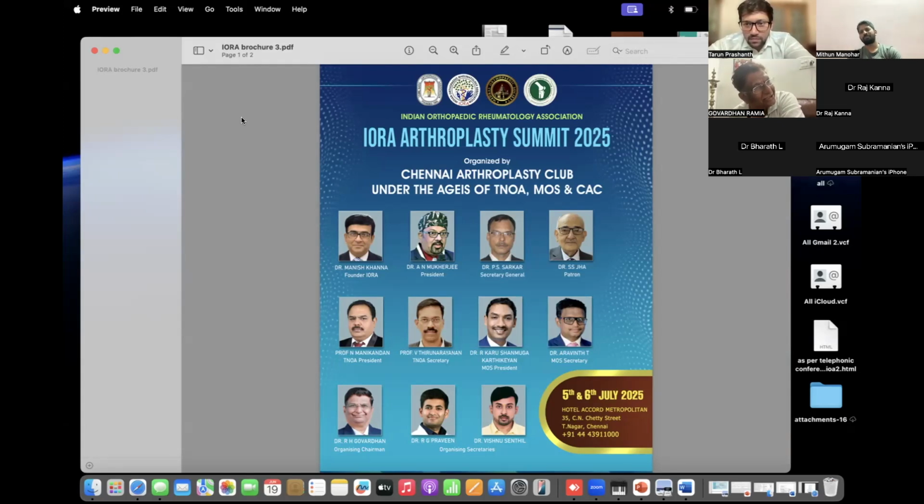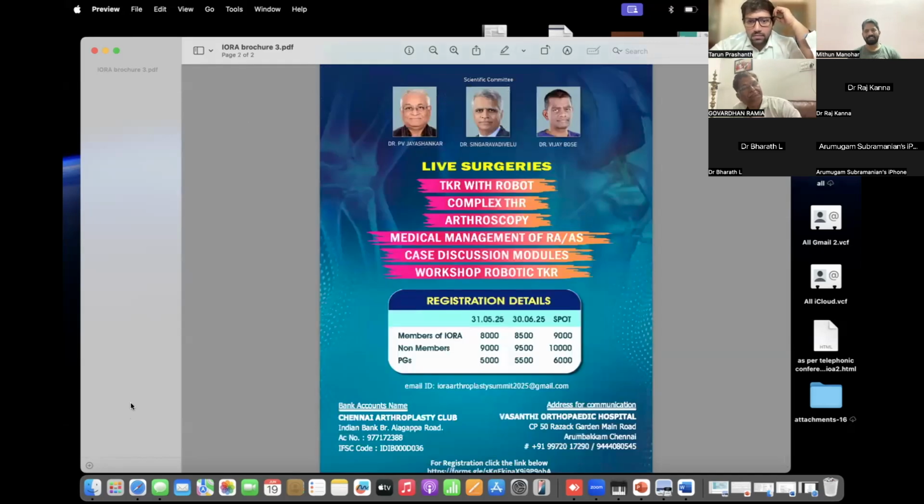Sorry for interrupting you. I was talking about lateral epicondylar osteotomy only in rigid cases. I was not specifically talking about this patient, sir. In this patient, I would in fact have gone with a CR. I was talking about cases where it is very rigid, the MCL is lax and you are not able to balance. I will not go on releasing tissue after tissue. I would rather do an epicondylar osteotomy so that the tissues are all intact, when it is rigid and in severe valgus and you're not able to balance. Not in this patient. That is what I was also telling.